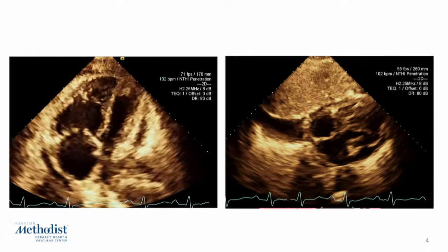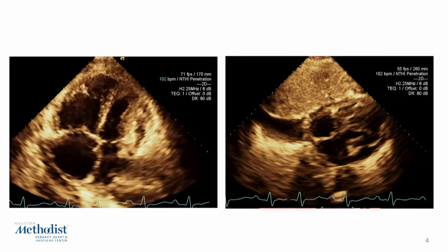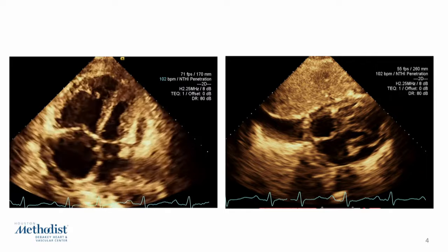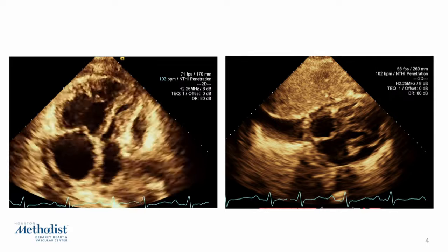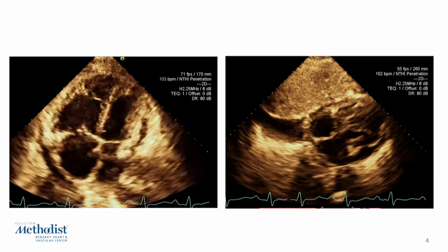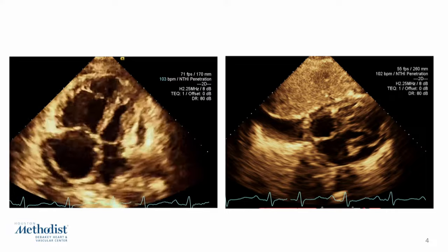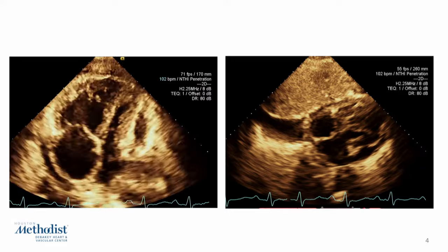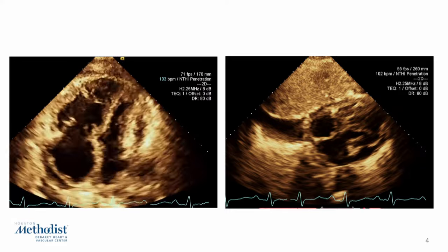So what is different about this, guys, right? That's the component you want to focus on, right? So it's an LV diastolic collapse, right? In patients with severe pulmonary hypertension, you're not going to see those classic signs because the RAP and RV diastolic pressures are super high, so you're obviously not going to have the typical RA/RV collapse. In these patients, you want to look out for LA and LV tamponade, right? So in this case, you clearly see that there is LV diastolic collapse.